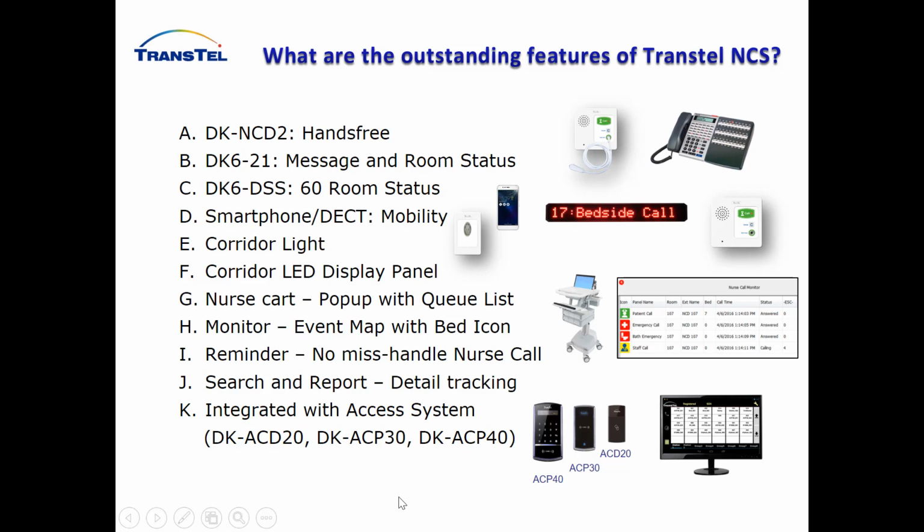Then the final one is that our nurse call is integrated with the access system, because at the nurse station they have some special rooms, for example medicine, that only staff can access. They use access control devices outside the room so that only people with access rights can enter.